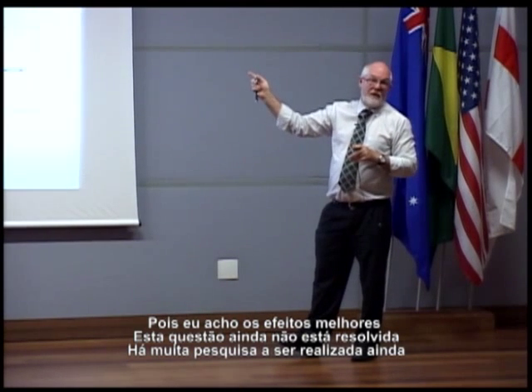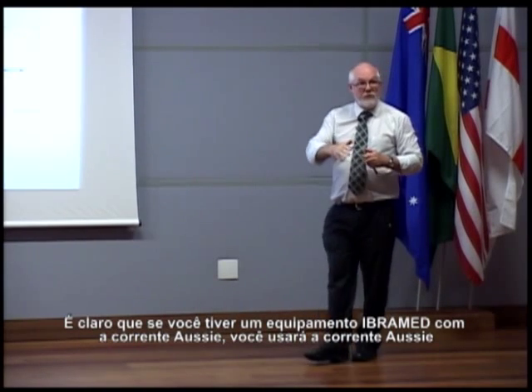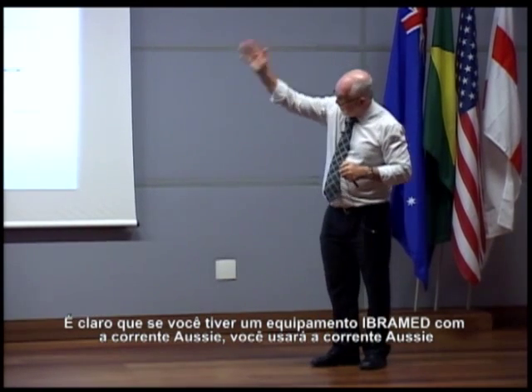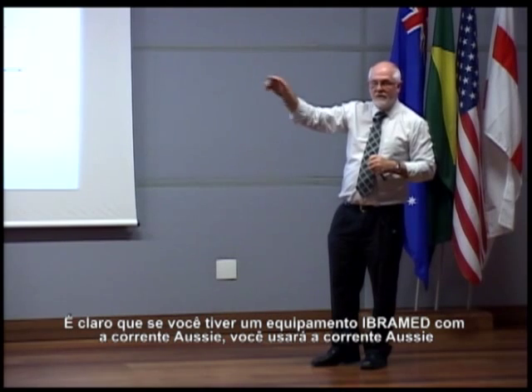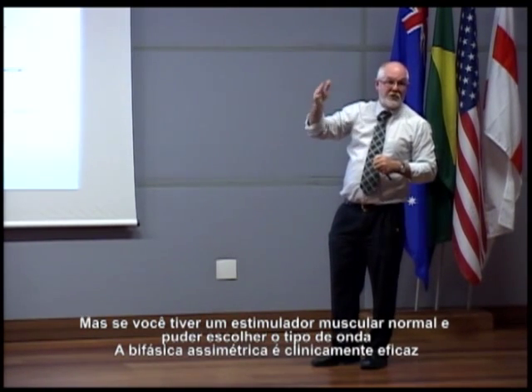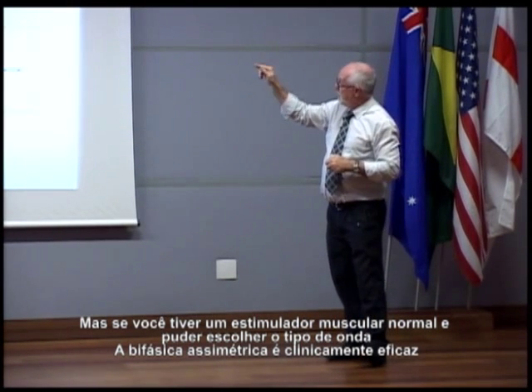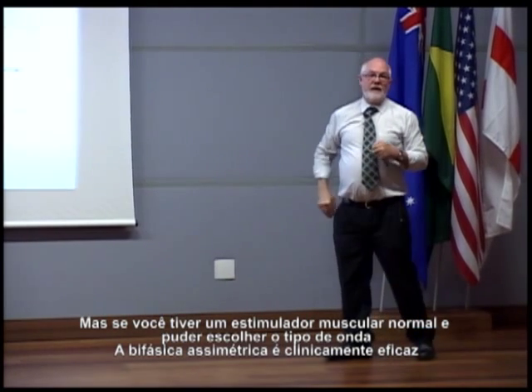We haven't resolved that one yet. I think there's more research to do. Of course, if you've got an IBRAMED machine with Aussie currents on, you can do Alex's Aussie currents. But if you've got a normal muscle stimulator, and if you can choose your waveform, biphasic asymmetric is clinically effective.